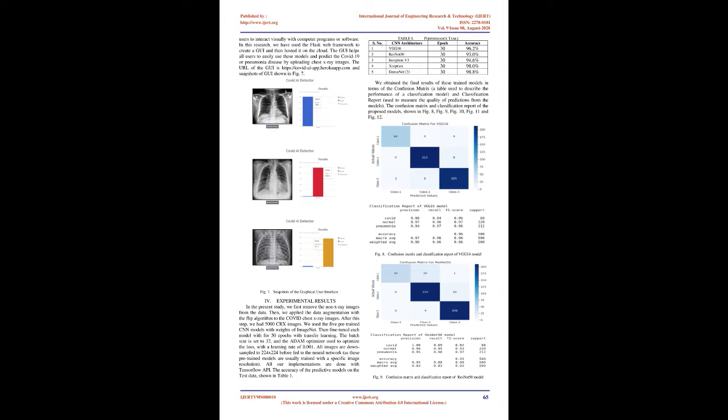The input is a fixed size 224x224 RGB image. The convolution layers use 3x3 filters, and the 5 max pooling layers are of size 2x2, followed by 3 fully connected layers and the last layer, the softmax layer. All hidden layers undergo ReLU activation.